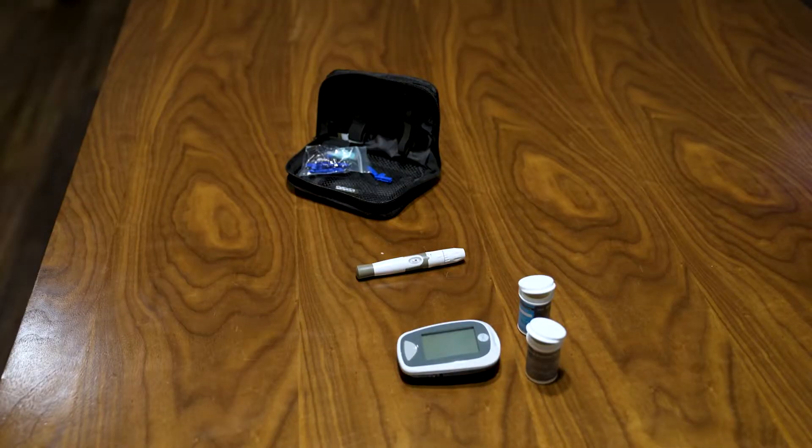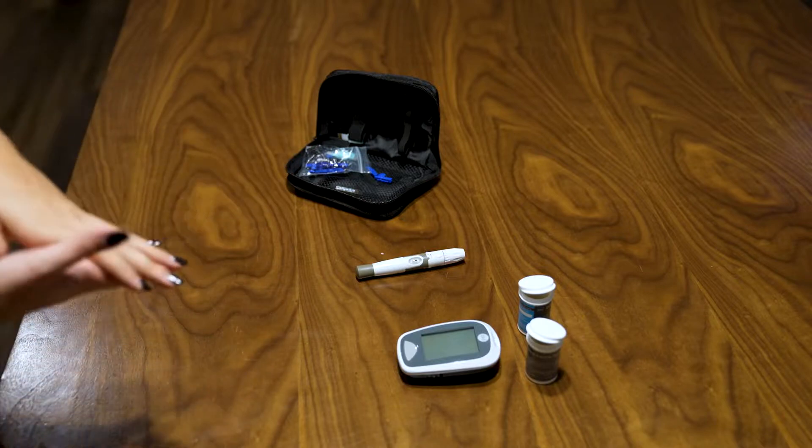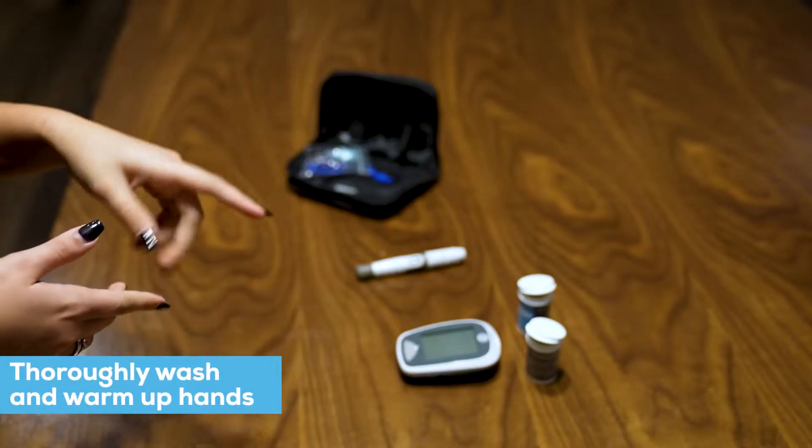Hello everybody, so today I'm going to take you through the glucose and ketone test finally. First, wash your hands — I just did with mine, so please do with yours as well.